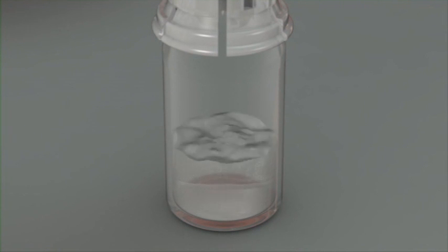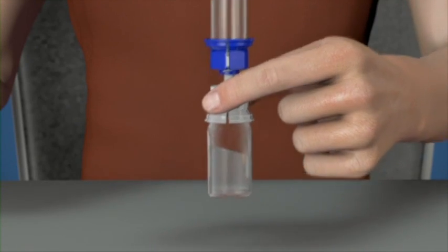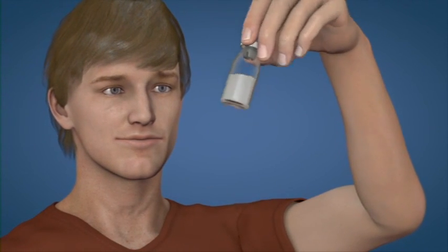The diluent will automatically flow into the product vial. With the diluent and product vial still attached, gently swirl the product vial to make sure that the powder is fully dissolved. Do not shake the vial.